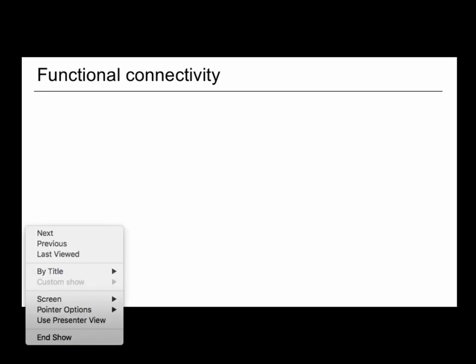Unfortunately, we haven't had Katie's lecture yet. I think she's probably going to cover this very well on Monday, but just to give you a really brief overview of what this means, to get us all on the same page. In functional connectivity, instead of looking at the magnitude of activation to a task in any single brain region, we're looking at pairs of brain regions or multiple brain regions at a time and how their activity is fluctuating together over the course of the scan.